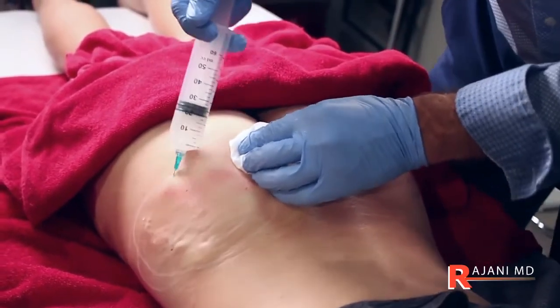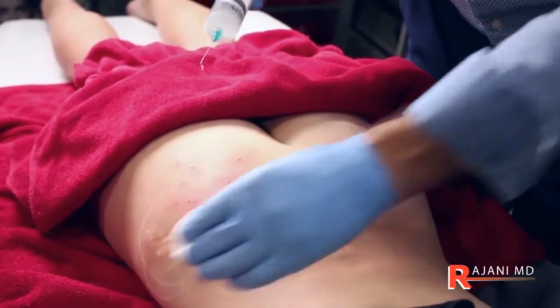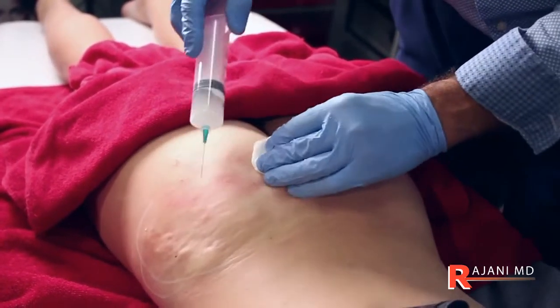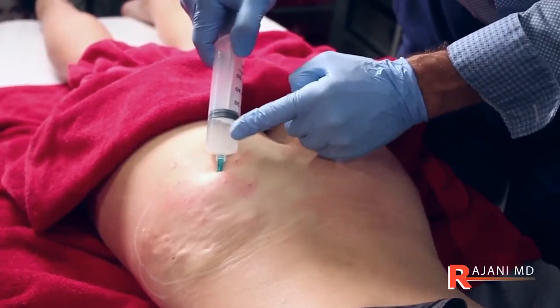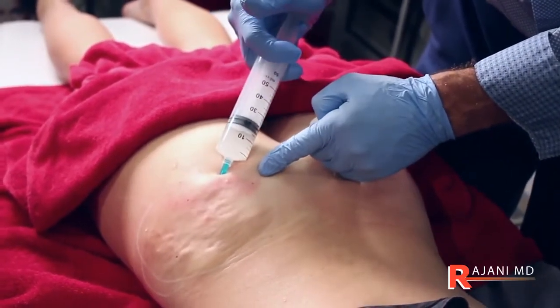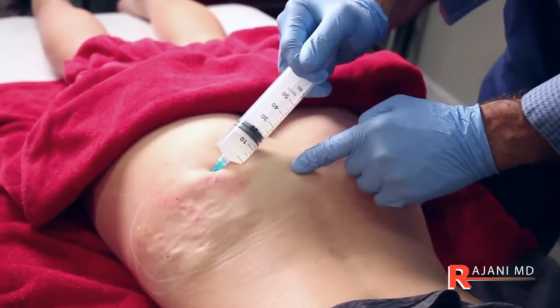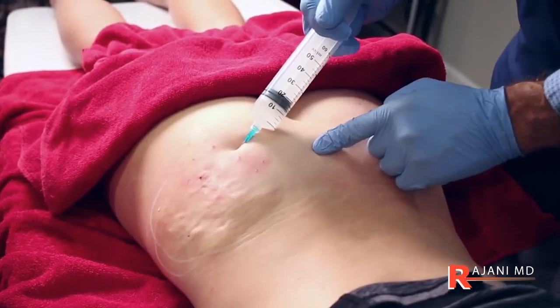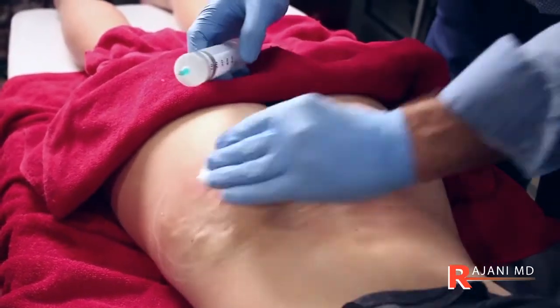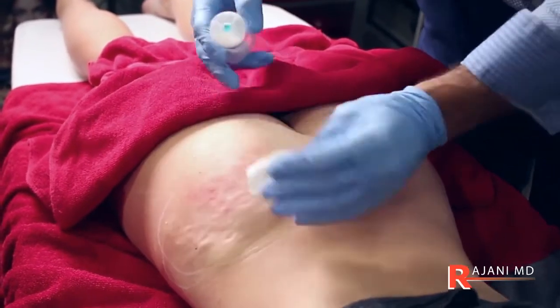Someone asked about pain level and local anesthesia. The beauty of these procedures and everything we do, there's no anesthetic needed. We have lidocaine in here. You always have to worry about lidocaine toxicity. You don't need very much at all. There's just a couple cc's of 1% lido. I don't use topical anesthetic. Most of my patients want to be in and out, and they don't want to feel numb for a while. But actually, this doesn't hurt much at all.